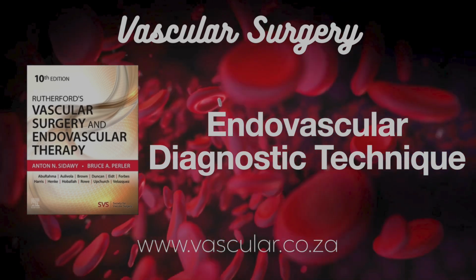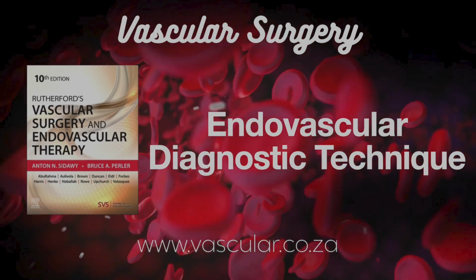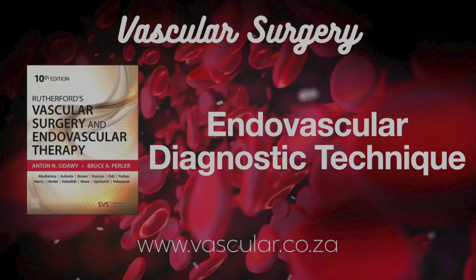And lastly, pelvic congestion syndrome venography. Similar principles to arteriography, but venous. Access the common femoral vein. Do an initial venogram, look for contrast washout near the renal veins, suggesting reflux from gonadal veins. Then selective work.